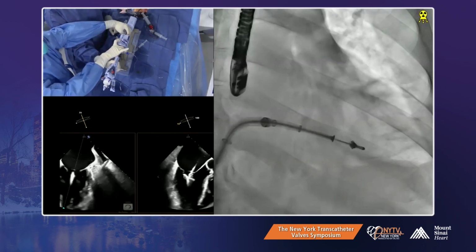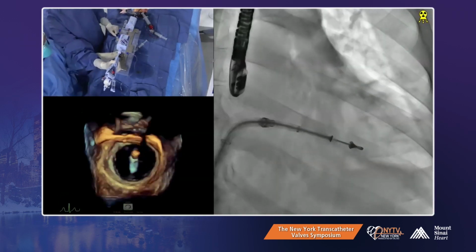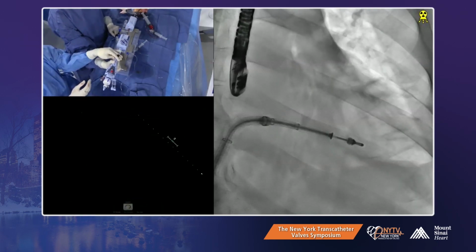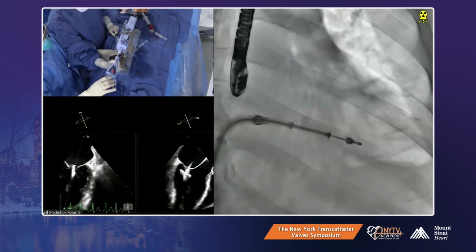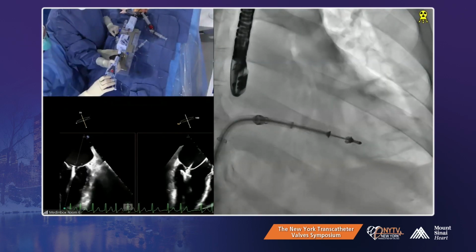We also overstraddle a little bit too. Okay, not that bad. Okay, are you guys happy with the orientation? A little bit of counter. Counterclock? So going just in the middle of the jet, where you get the most leaflet, least cord.